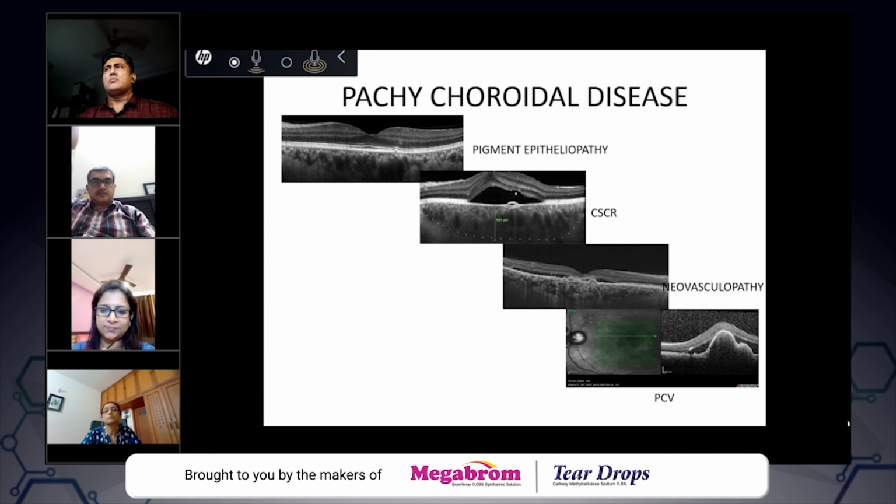If you have a suspicion, if it's a PCV, if clinically and your OCT is telling you that it is PCV, then ICG also will be done. Generally, we will do FFA alone only in diabetic retinopathy and CSR, but otherwise, for any choroidal lesions, we will combine it with ICG. Okay, sir, and about monitoring response of anti-VEGF in case of AMD.